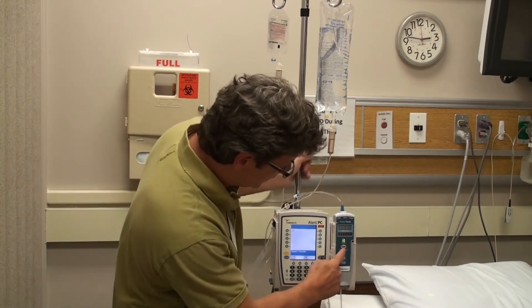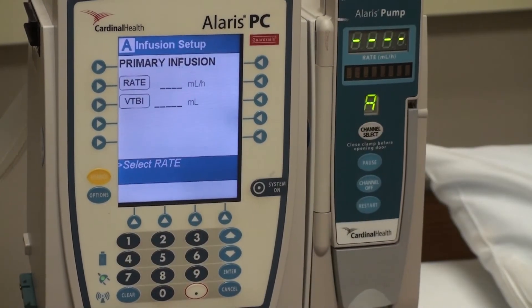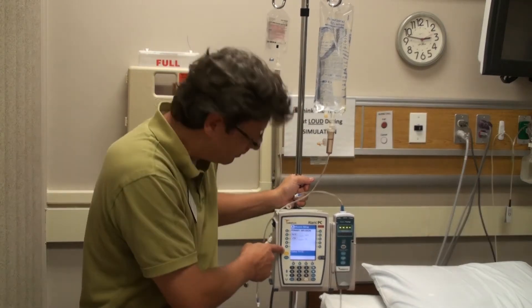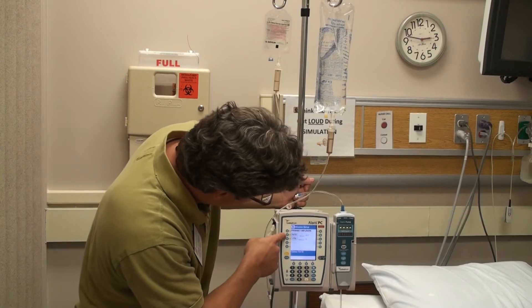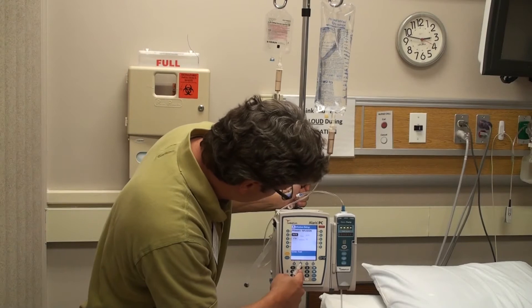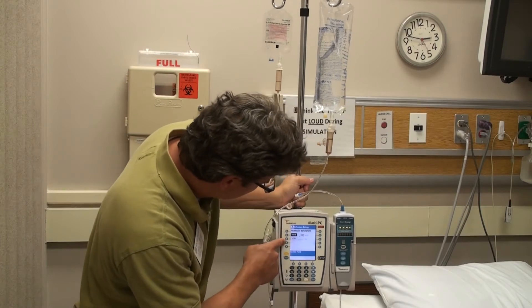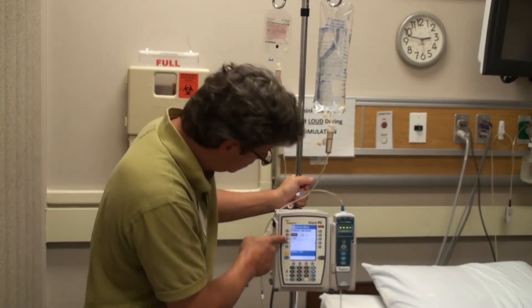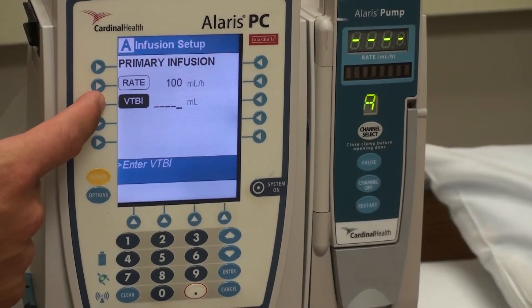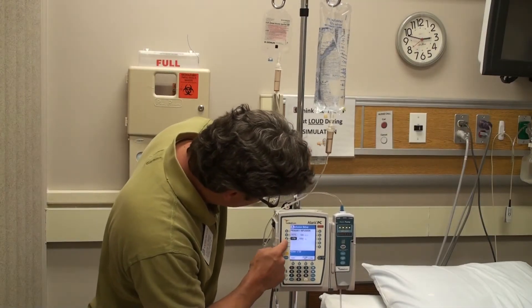What you're going to do is click channel select on this unit here. It's going to ask you for a rate, and you've got buttons on the left-hand side of the Alaris pump. You're going to select the arrow next to rate — for this one let's say 100 milliliters per hour. And then underneath VTBI is the volume of the bag, which in this case is 1,000. Select that and enter 1,000, and then you're pretty much ready to go.